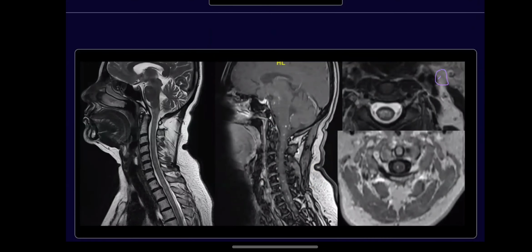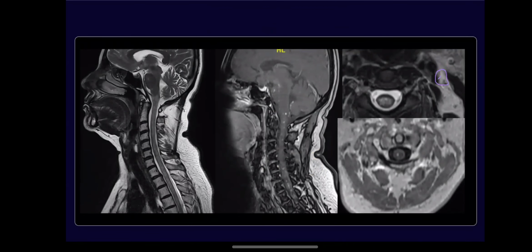And we got a spine screening, and we were very surprised. We saw this extensive involvement of the spinal cord as well. There's extensive white matter changes, intramedullary signal changes in the spinal cord, and white matter changes in the supratentorial neuroparenchyma. We do see this dot-like enhancement in the spinal cord as well as the pons.